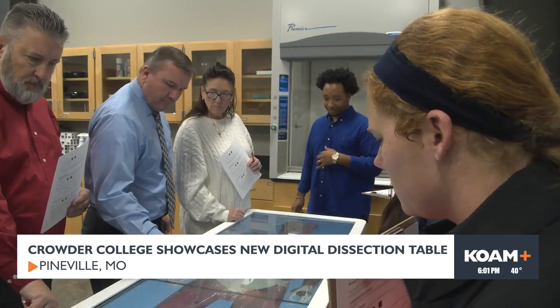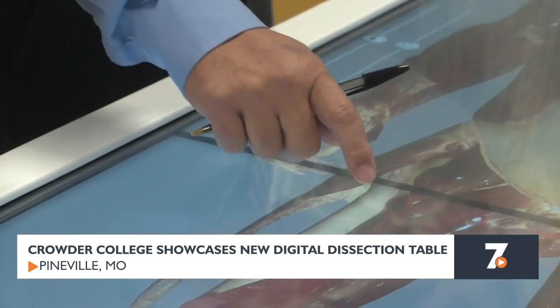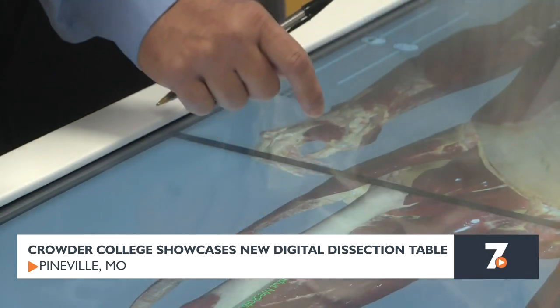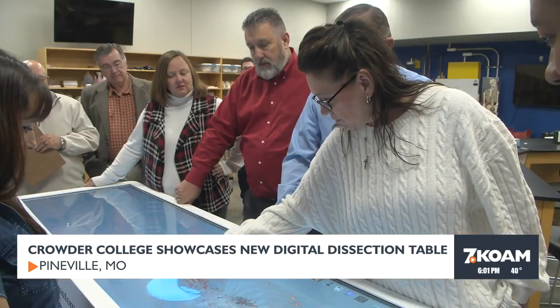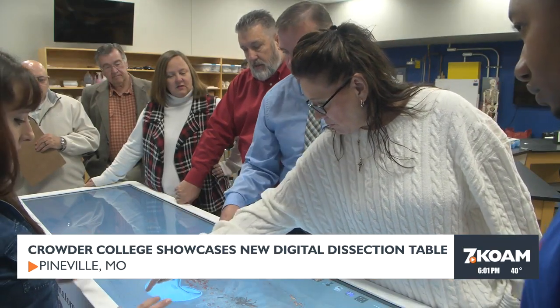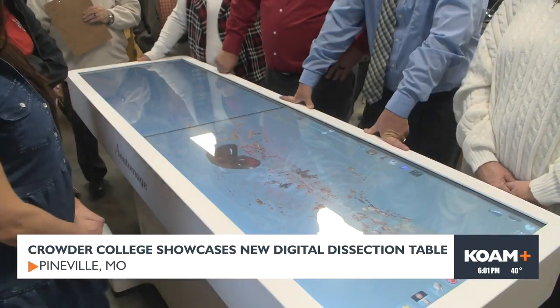Victor was 33 years old at the time of his death and died of leukemia. So when we look at his anatomy, we can see the pathology that's there. Victor has an enlarged liver, an enlarged spleen, and enlarged lymph nodes due to the stage of leukemia that he was at the time of his death.